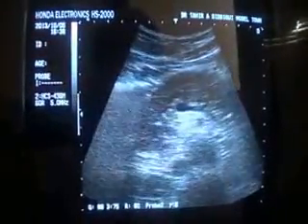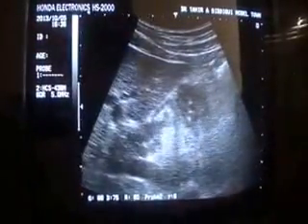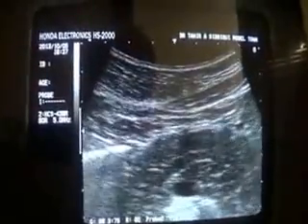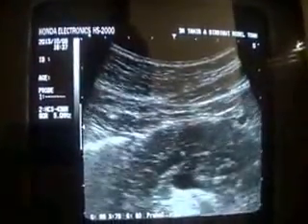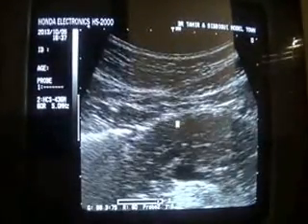Its tail, its head, its body — all have multiple echogenicities. In one view we are getting these non-shadowing, shiny calcifications: 1, 2, 3, 4, and 5. This is the head of the pancreas measuring 2.3 cm. This is the body of the pancreas, and here you can see a very interesting thing that we were not seeing while the patient was in supine posture.